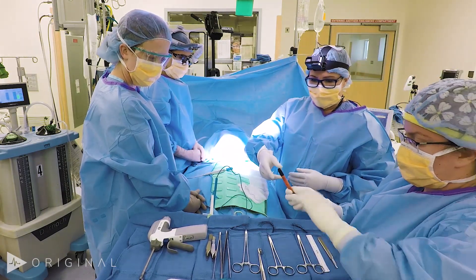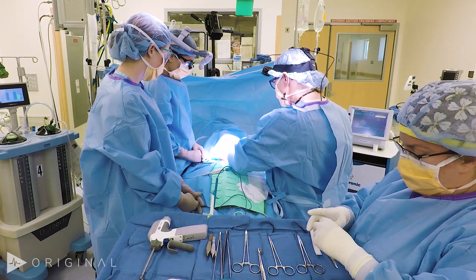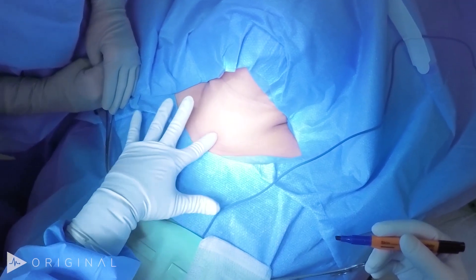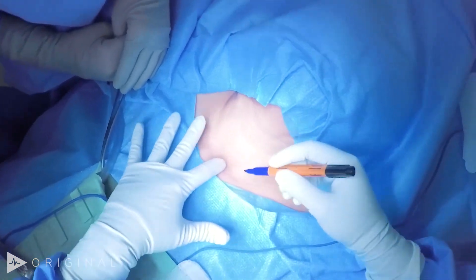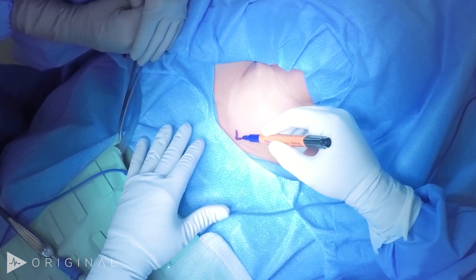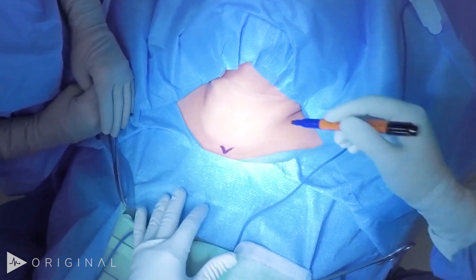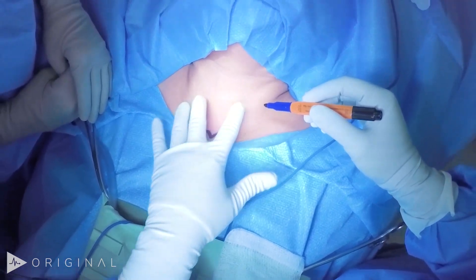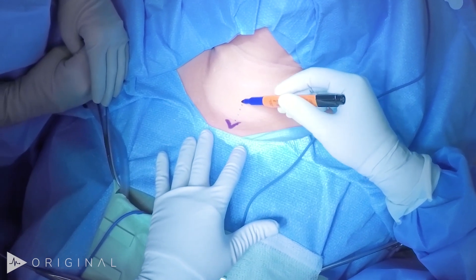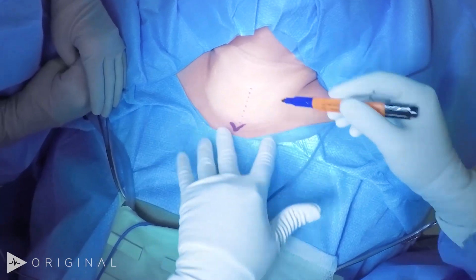We're going to go over some important landmarks to see how we make this incision. This patient has a short neck with a little excess adipose tissue. We're going to find the sternal notch and find the midline — when you have a thick neck it is a little more challenging to feel, but the trachea here is midline. You want to be sure that if there's any deviation from the mass, you account for that with the midline of your incision.